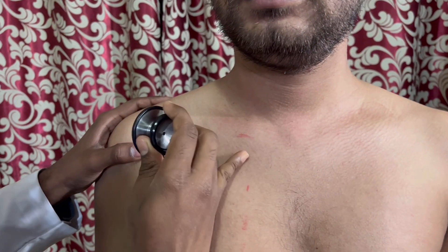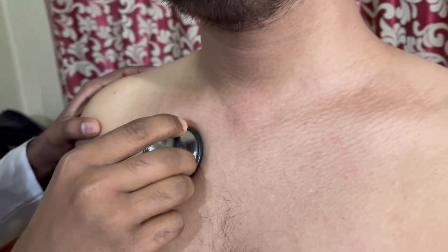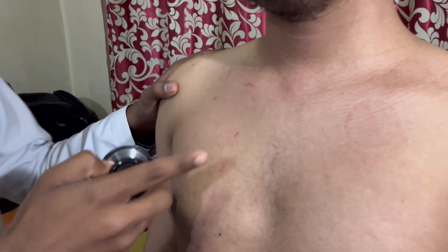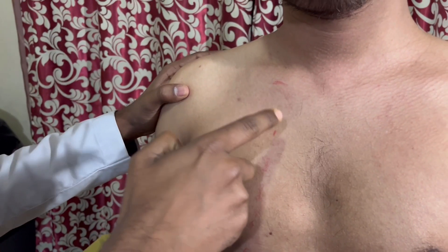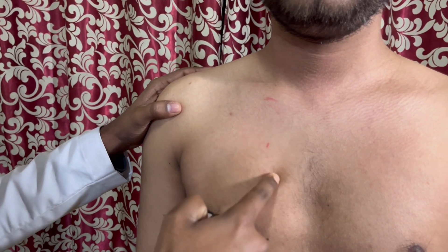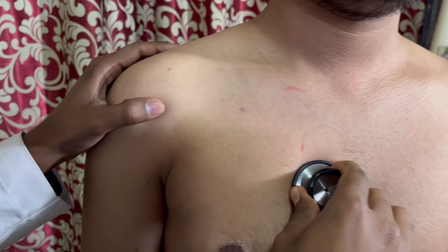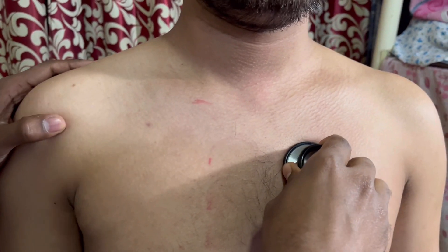Then the infraclavicular fossa, right side then left side. Then we auscultate along the mid-clavicular line at the second and third intercostal spaces — first on the right side, then again to the left.